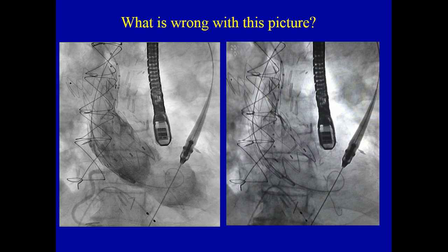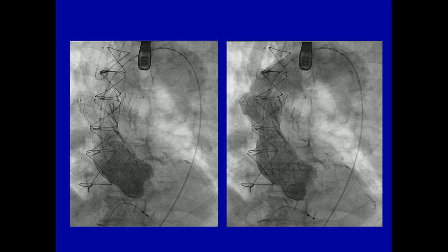But you can imagine if you have a wide open aortic regurgitation, presumably from the stent graft manipulation of the aortic valve, you will perfuse and pressurize the entire LV and will probably not help the patient's LV recovery subsequently. So in this case, I actually put a balloon in, and you don't have to pull on that balloon, but you inflate it large enough for the cardiac output to push that balloon back. And within literally a minute or so, we have this image suddenly. The stent graft has come back just enough not to involve the aortic valve.